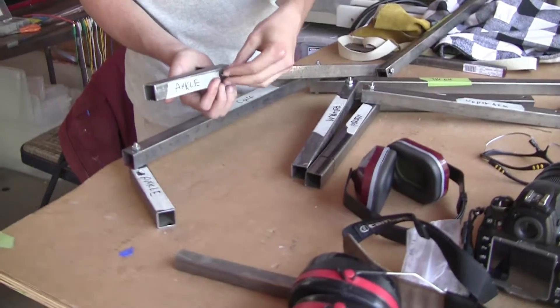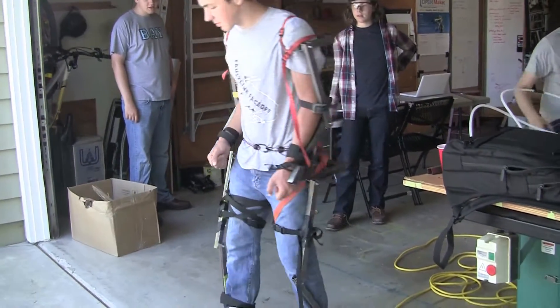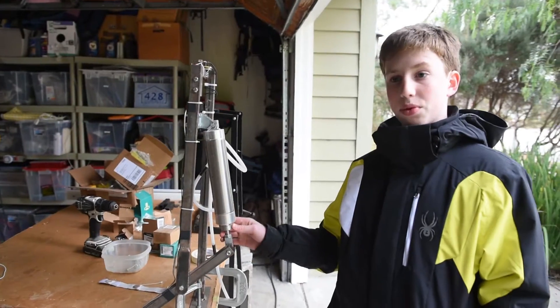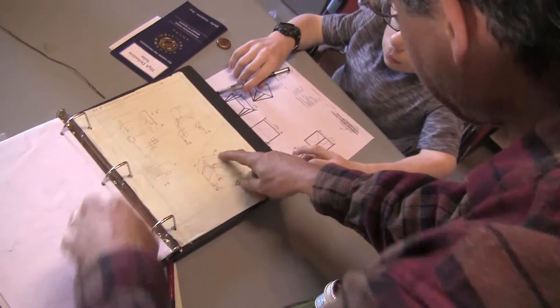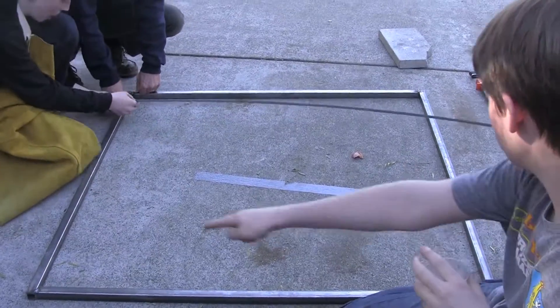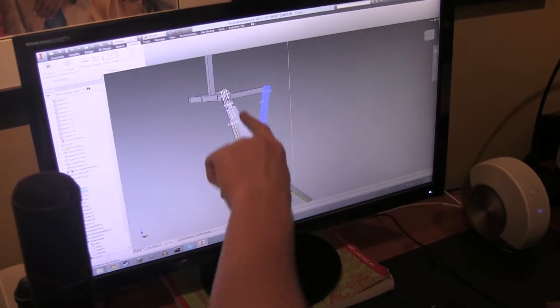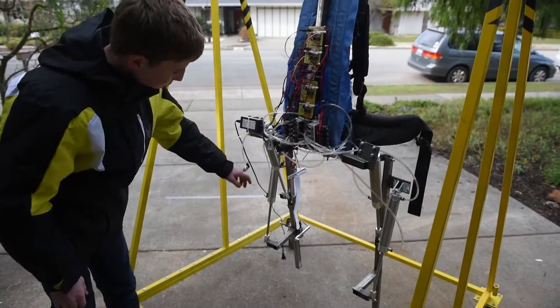We started by building an unpowered armature to tell us what the limb lengths needed to be and where the joints needed to be. Then we built a prototype elbow to experiment with different forms of actuation and sensing. We took what we learned from these prototypes to make a prototype leg model with custom PC boards, pneumatic actuators, and linear potentiometers.